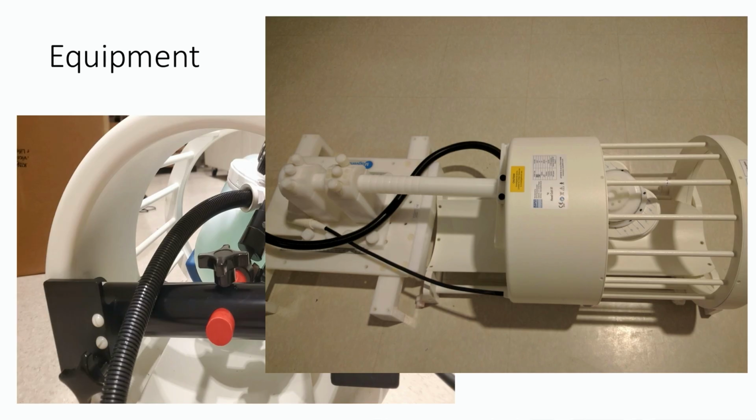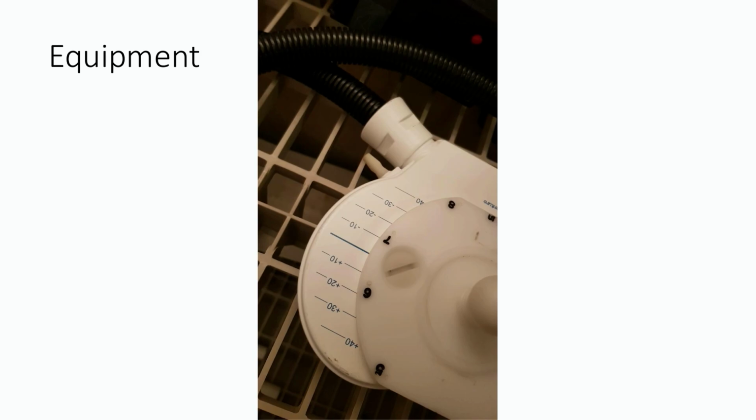The downside is that it takes a really long time to get it into place and to work it into the places that you want, and I always want to stimulate multiple brain areas, so I'm running in there trying to pull out the participant and reposition the TMS coil. So for us, our custom-built solutions have worked a lot better. All right, so that's what it looks like, TMS coil, little holder.